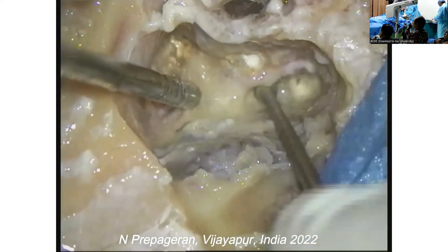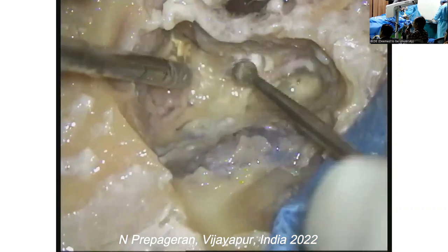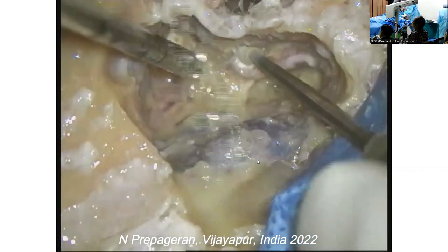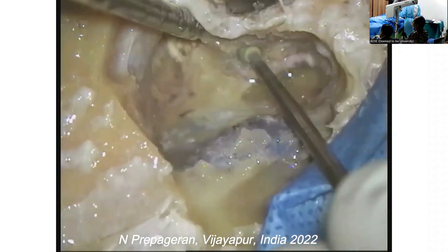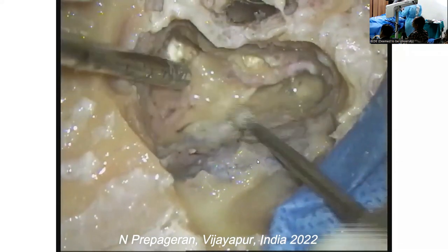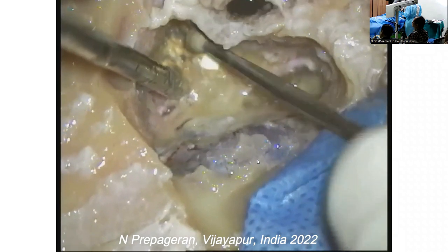See, if you look at this, I'm already under the facial nerve. That's already the inferior part of the facial nerve. So now I'm going to go to the middle ear space. I'm using a big diamond though, so by right I should choose a smaller one that will take me straight into the middle ear space. The burr's too big. So anyway, now let's follow the facial nerve all the way.